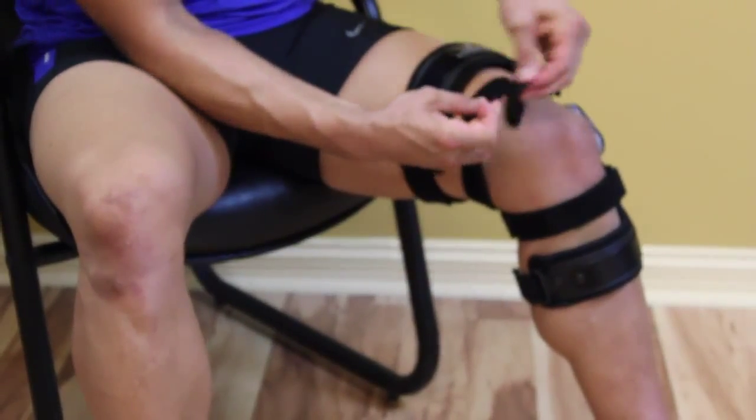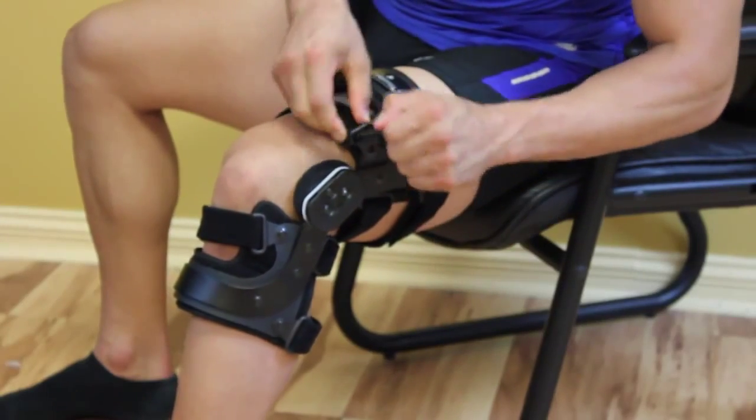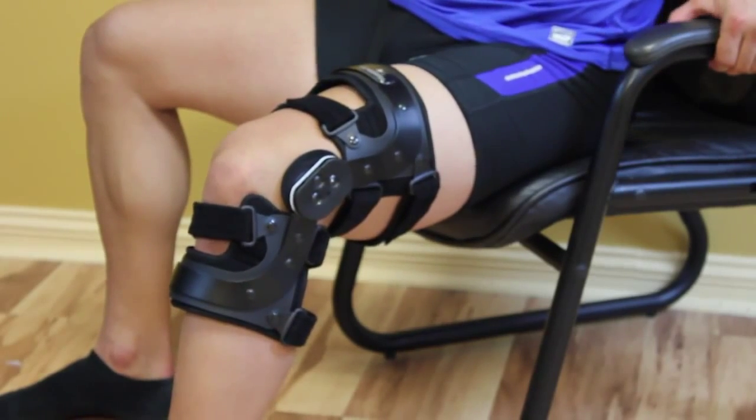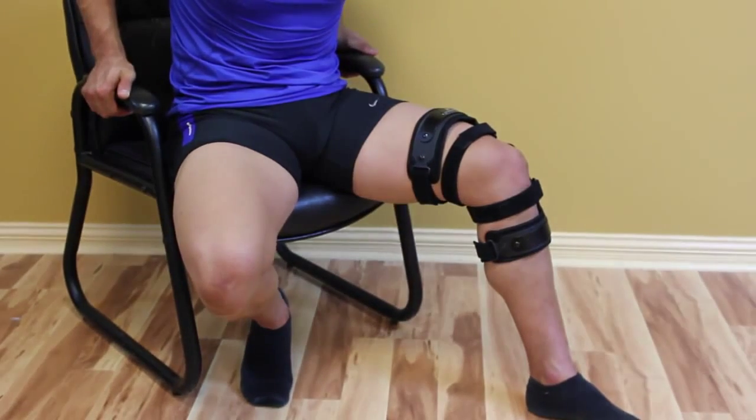Finally, fasten the second highest strap of the brace. When strapping is complete, the center of the hinge should be just above the top of the patella and one inch above the knee joint line.